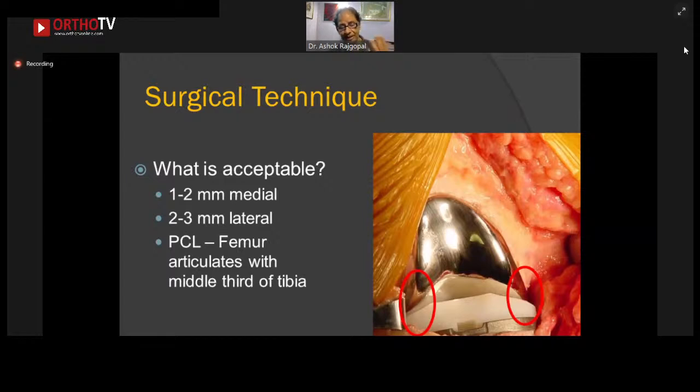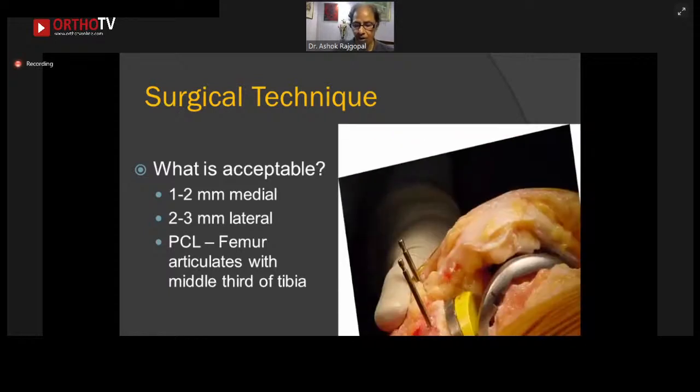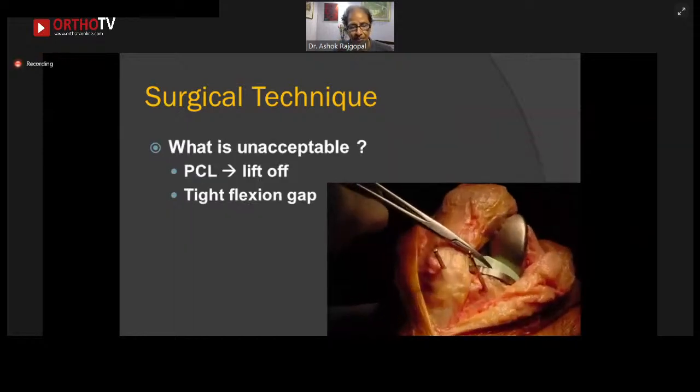This is something that I picked up from Dr. Insall and his group. Your knee should open about 1 to 2 millimeters on the medial side and 2 to 3 on the lateral side, and this is in about 10 to 15 degrees of flexion. And if you are a CR retainer, then you will see on certainly the trials that we use, that we have these lines. They're both on the femur and the tibia, so the middle line on the tibia should align with the middle line on the femur.